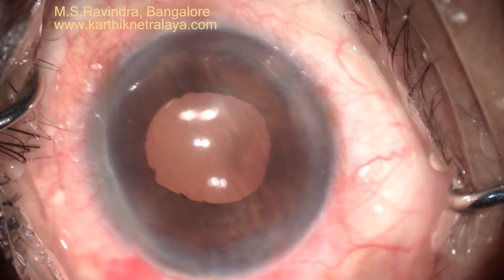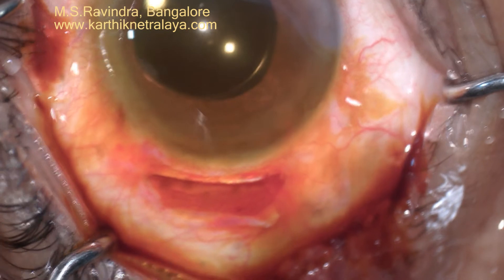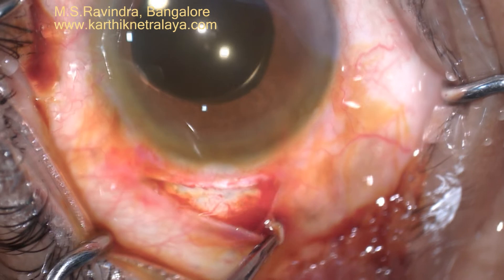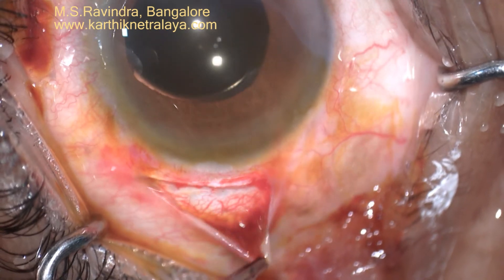At the end of surgery, the pressure is checked and a drop of povidone is applied, then a drop of fibrin glue is used to close the tunnel. There is no other opening in the eye, and the only opening in the upper temporal quadrant is closed with fibrin glue.